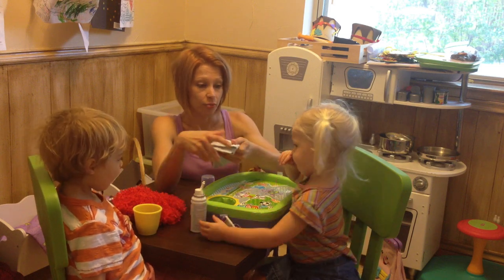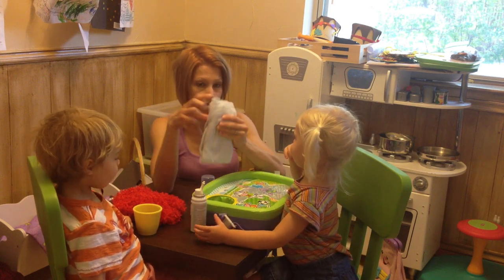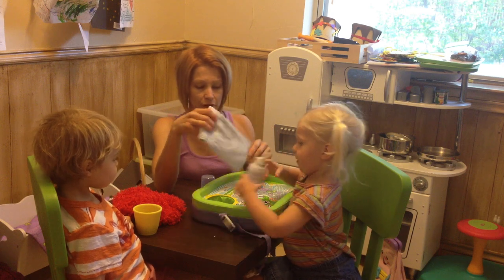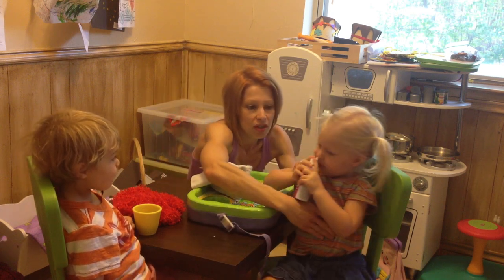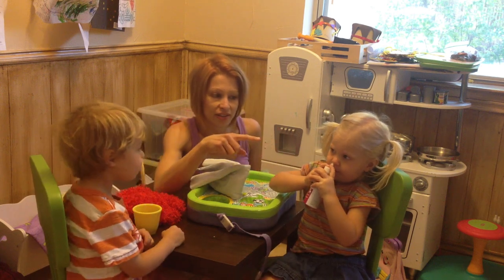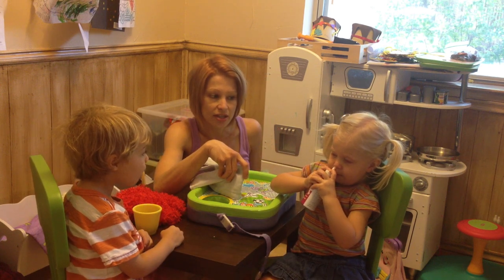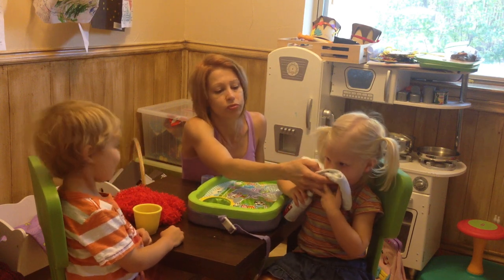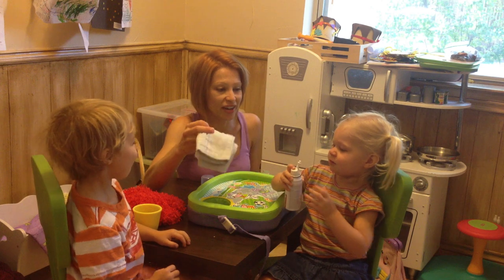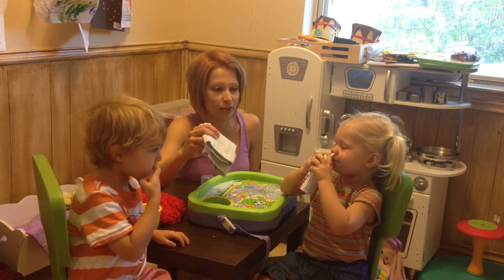I do use a cloth diaper — an old cloth diaper, a Gerber pre-fold — that I hold. Show them how you spray it. Just about to spray it in your nose. Press it down until it comes out. It's coming out below your nose. That was one nostril. Now, we're going to spray the other one.